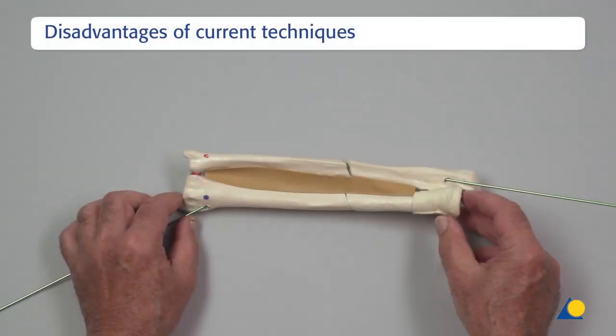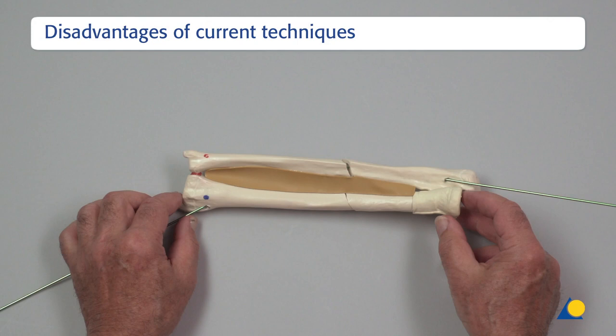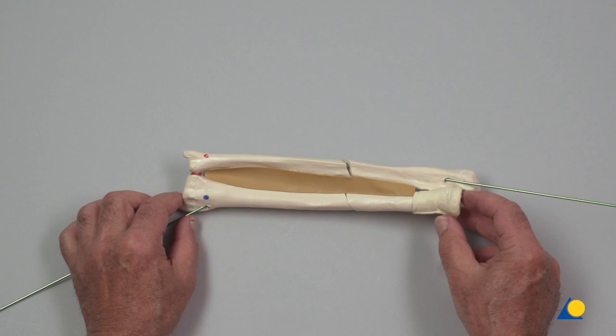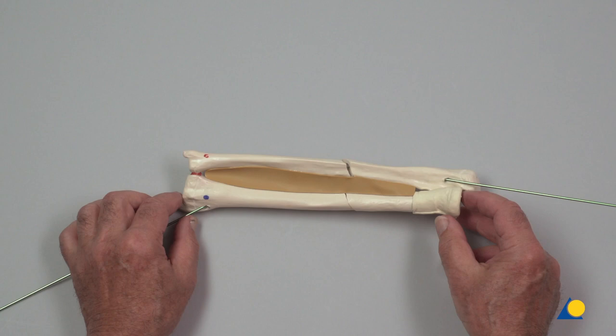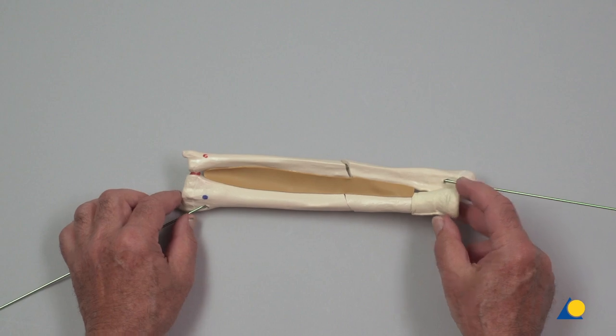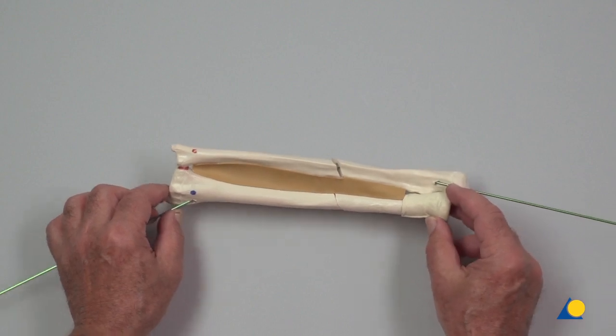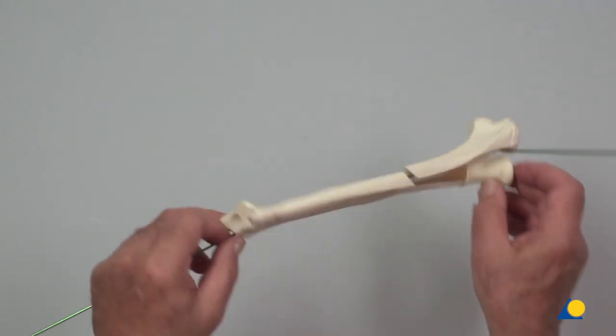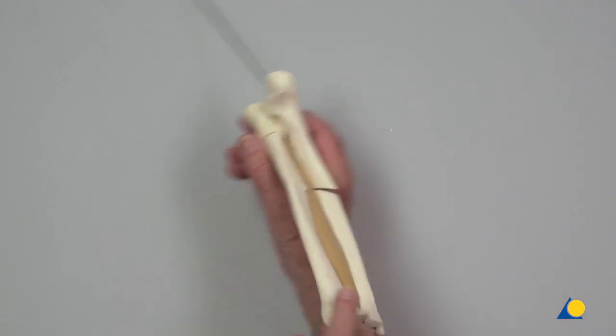The disadvantages of the anterograde technique are as follows. As the nails are entered distally and proximally, reduction may prove to be challenging as it is necessary to manipulate the nails simultaneously. The opposing position of the nails makes it difficult to perform intraoperative fluoroscopy. Due to the need for 180-degree intraoperative fluoroscopy, the arm must be regularly manipulated, which may lead to reduction instability.